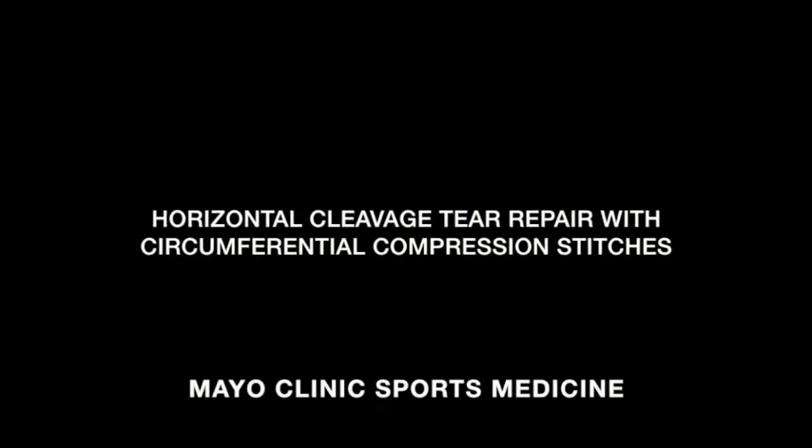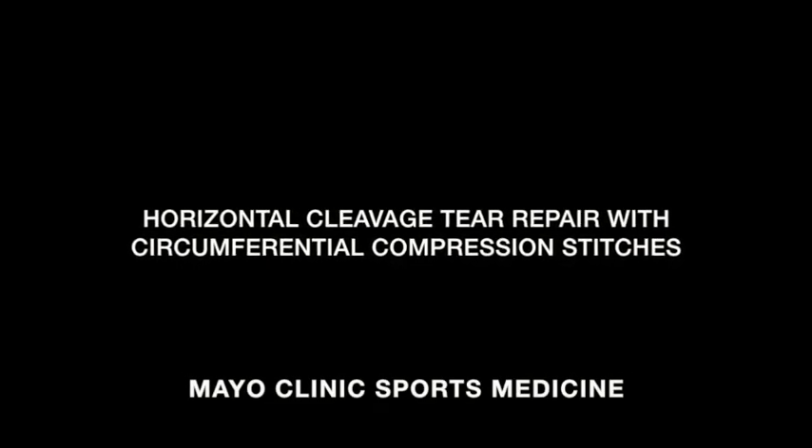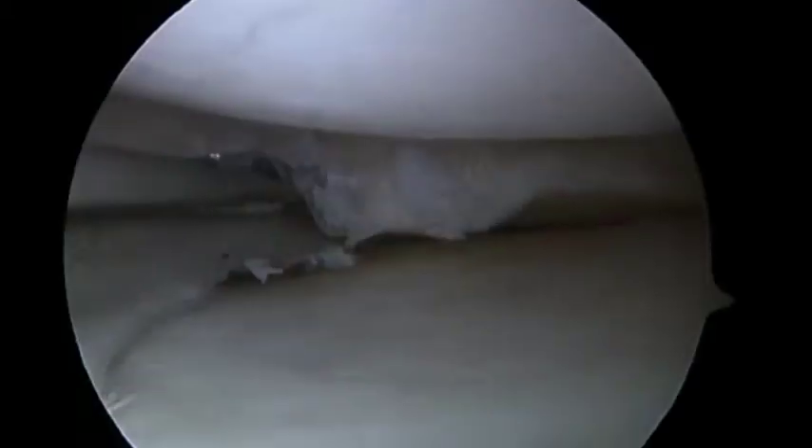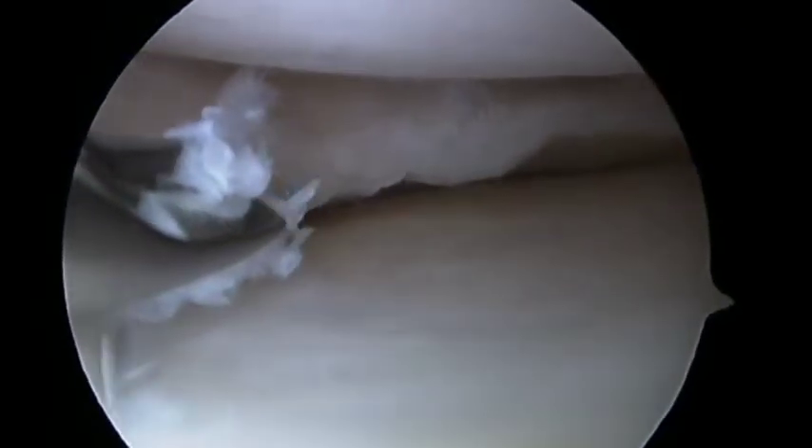The current video demonstrates a horizontal cleavage tear repair using circumferential compression stitches. The first step is to define the anterior and posterior margins of the tear. An arthroscopic biter is used to remove the most central portion of the meniscus to expose the horizontal cleavage tear. This will allow access to the tear site using a probe.